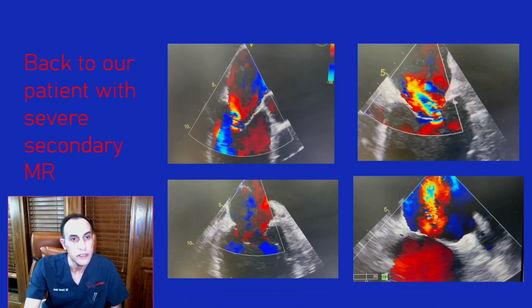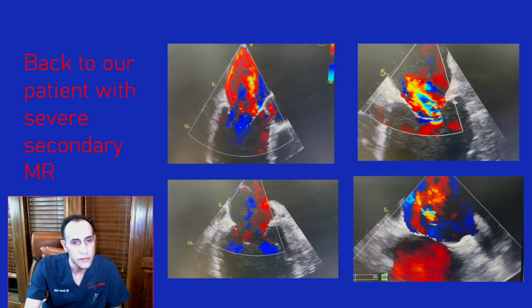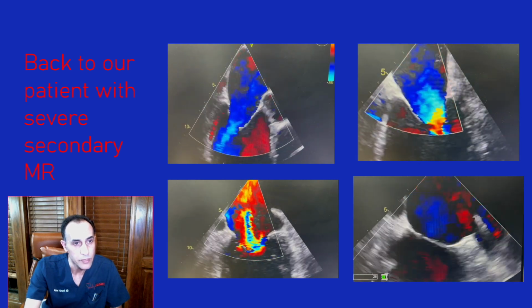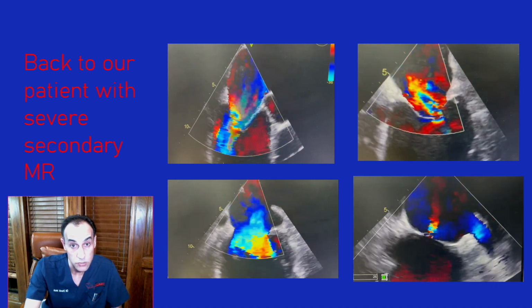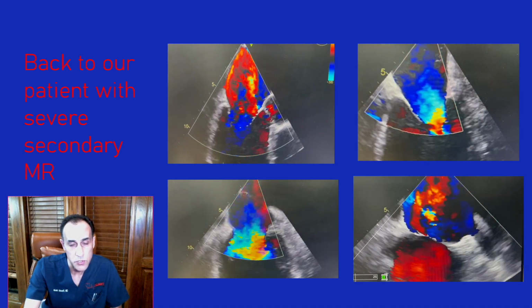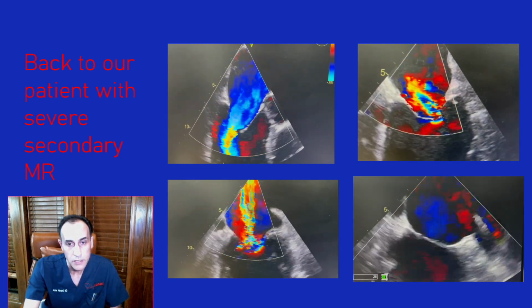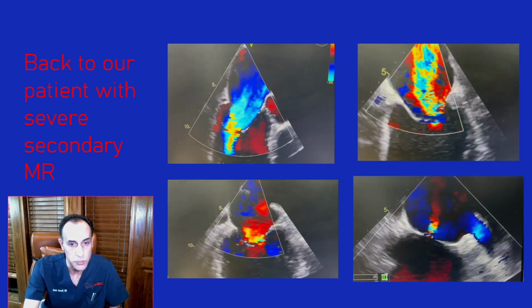So here you can see the TE images with multiple views, and as you can tell, there is evidence of severe mitral regurgitation. Also, the anatomy is suitable for MitraClip. We have enough posterior leaflet length, and there is no significant calcification or MAC. Also, there is no evidence of mitral valve stenosis. We also have to exclude any clot in the left atrial appendage with the TE to make sure before we proceed with the MitraClip procedure.